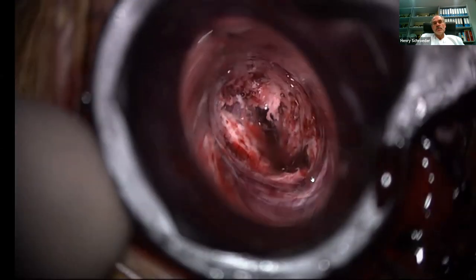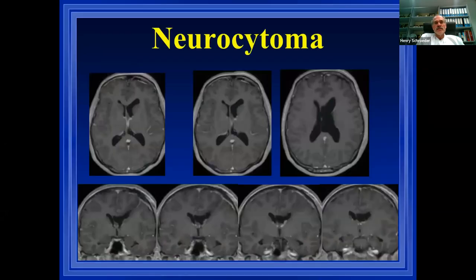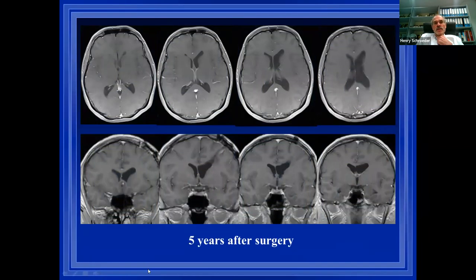And then we remove the tumor and have this resection. And it turned out to be a neurocytoma. You see, it looks not too bad. It was a lady from Russia. She sent me the images 5 years after the surgery, no recurrence, all is good.